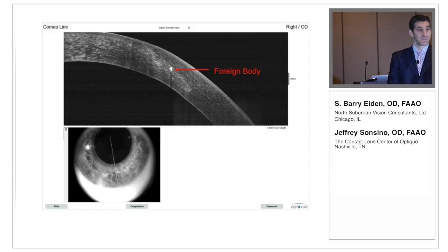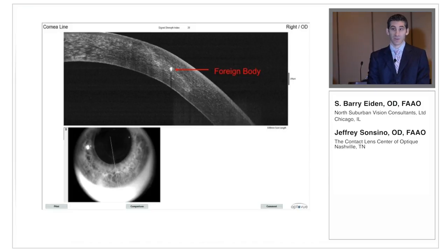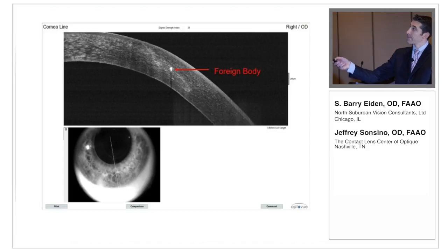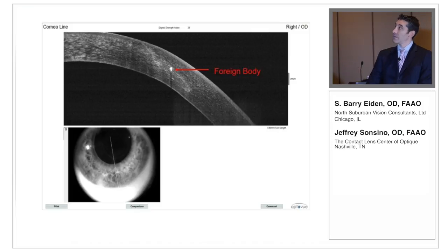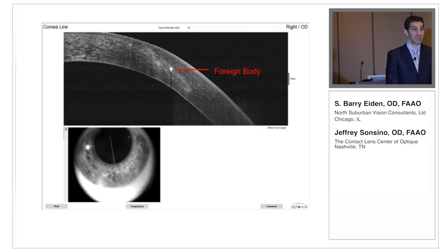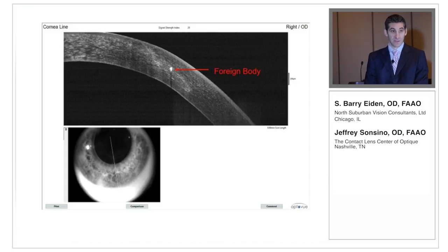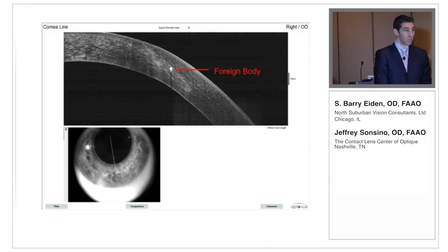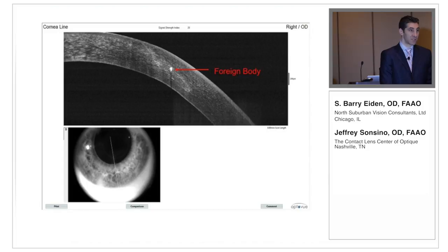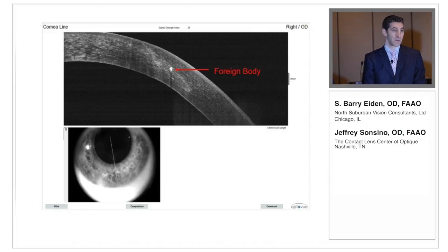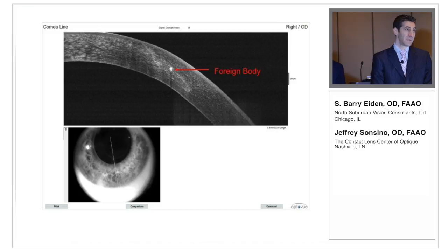We took the OCT and, clear as day, you can see this is a deep but partial-thickness laceration — so I immediately felt better about managing this case medically. We took a few more images and, lo and behold, there is a retained foreign body right there in the cornea — about 50% of the thickness of the cornea deep. We were not going to dig that out.